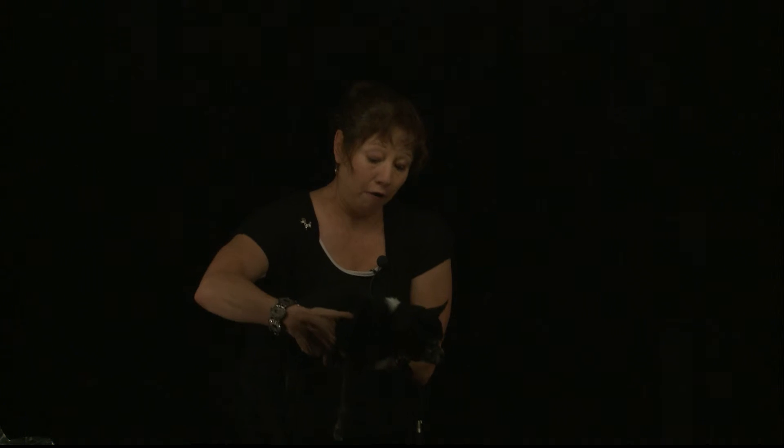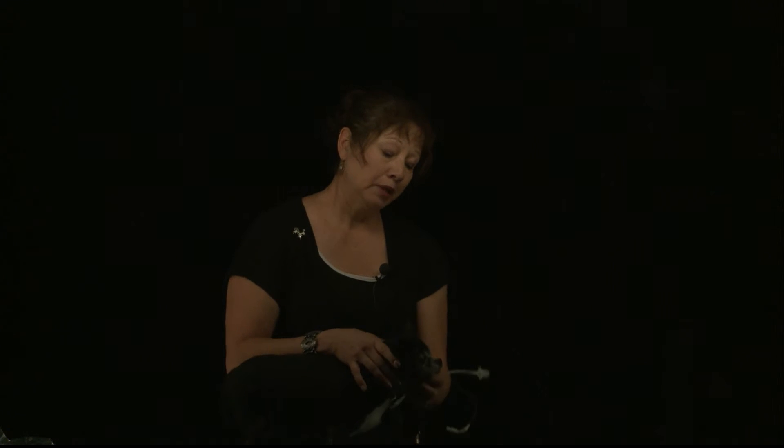I'd also like to use Mr. Bean to show you how to measure the tube itself to make sure you are not going to extend it past the thoracic inlet. Mr. Bean is a small dog with a small muzzle. When we measure him for tube placement, we place the end of the tube at the thoracic inlet, and we want it to be about mid-muzzle so we can tie it to either the upper maxilla or the bottom mandible. We then mark on the tube exactly where that point is — if we advance the tube any further than that mark, it would be past the thoracic inlet of our patient, and that is what we do not want.